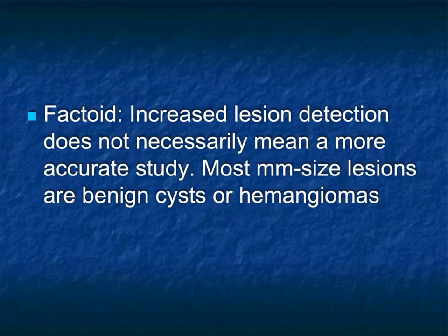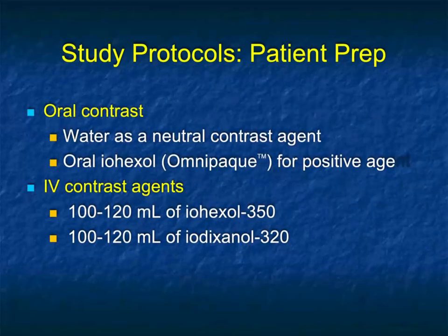So it's very important to go far beyond just detection and really go to classification. And in this lecture set that we're going to do, which will probably be 4 or 5 parts, we're going to spend a lot of effort trying to recognize specifically what lesions are.